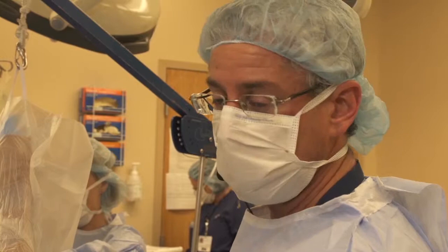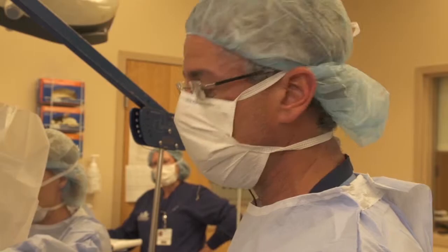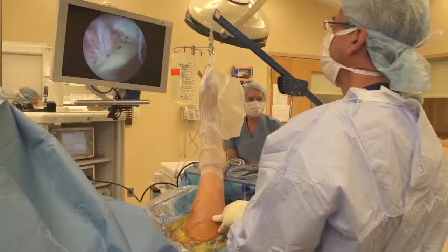Sort of a hybrid technique using the principles from our friends over at SCOE with their single row using the crimson duvet. I'm a double row guy, so we'll be able to take you through that technique and utilize these bone vents to try and help stimulate rotator cuff healing.